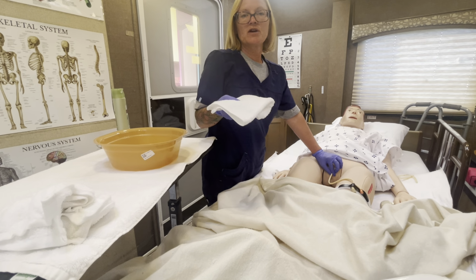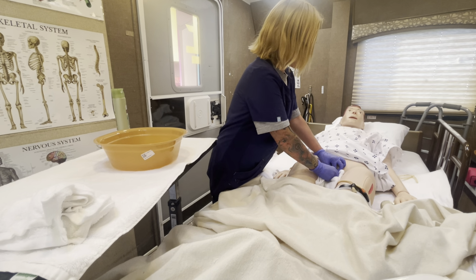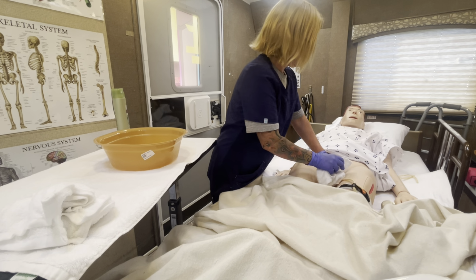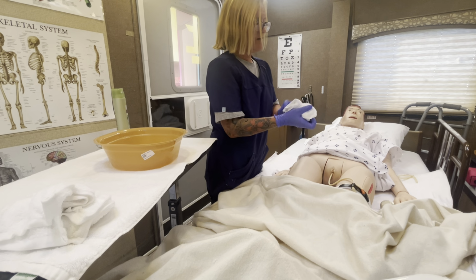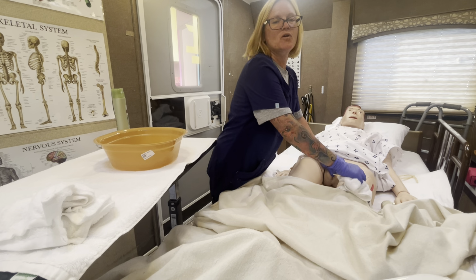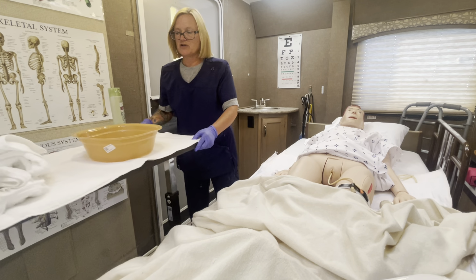My last one is going to be a dry towel because I need to dry the area. So then I'm going to take my first corner, dry 4 inches down. I'm going to turn my leaf, pinch at the meatus, go 4 inches down. One more, pinch at the meatus of the catheter, and go 4 inches down. I am all done with that portion of it.